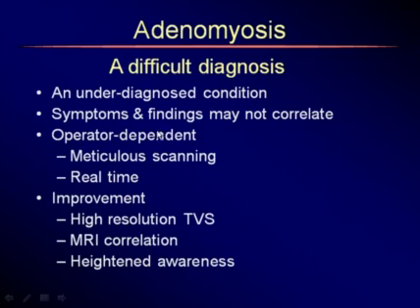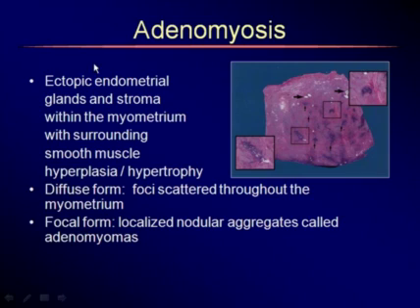It is operator dependent. You have to do careful, meticulous scanning and use higher resolution. MRI has helped a lot in this diagnosis and certainly is a way to correlate, and also heightened awareness among patients, clinicians, and diagnostic imagers.